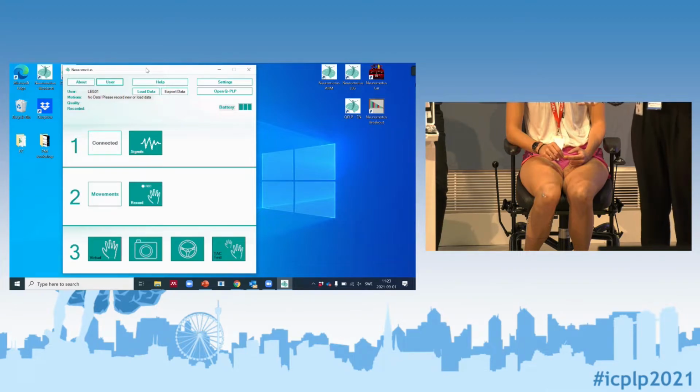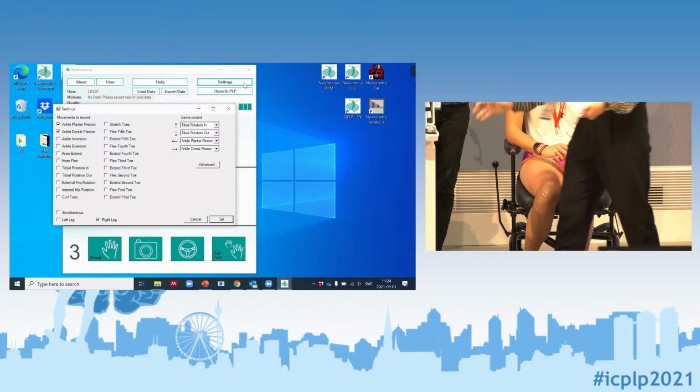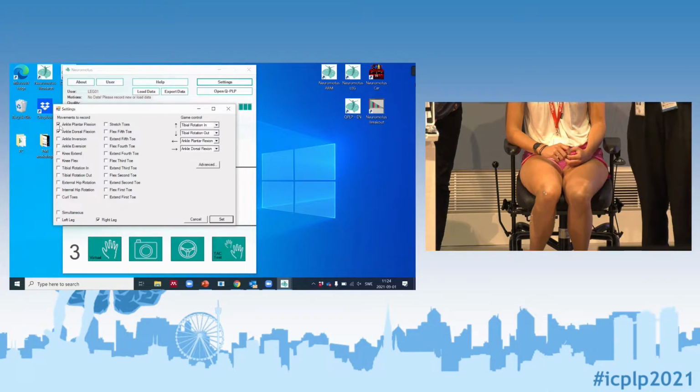So in this main treatment, as Max and Corry were explaining, we want to promote phantom motor execution. So the idea is that we are going to select different movements to mindfully practice this movement in different levels, and we need to keep the patient constantly challenged. So before starting, you will see that the program will offer multiple options of movement that you are able to train with your participant. So for today, we are going to start with, for example, ankle dorsiflexion and inversion and eversion with our patient.